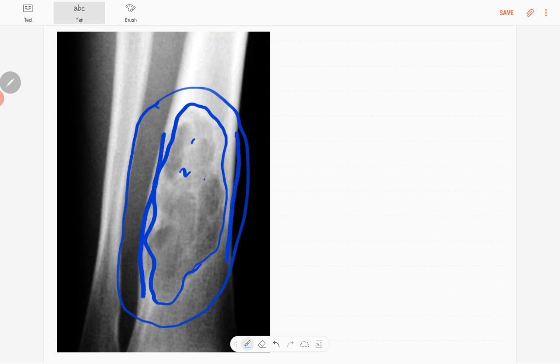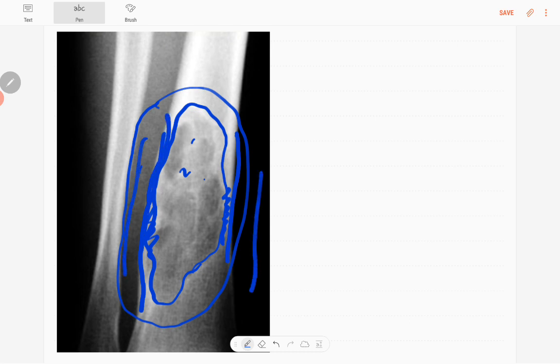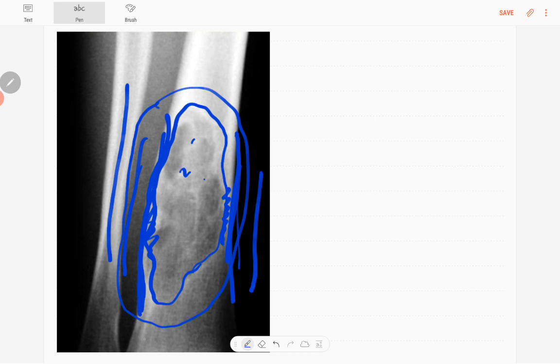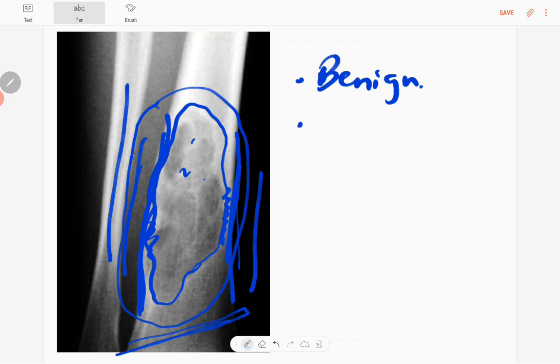There is endosteal scalloping in this region, no cortical breach, no soft tissue component in this region, no periosteal reactions, no complications like pathological fractures. You can't see any synchronous lesions in the fibula or rest of the tibia. Epiphysis is spared. So it's a benign lesion with no complications.